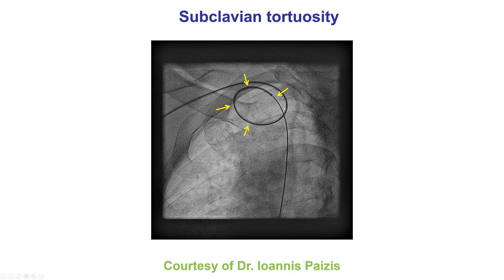This is another example of subclavian tortuosity. Sometimes catheters and wires can go through subclavian tortuosity; however, manipulation is then extremely challenging because of the significant bends on the catheter. In cases like this, it may be best to change to the contralateral radial axis or to femoral axis.